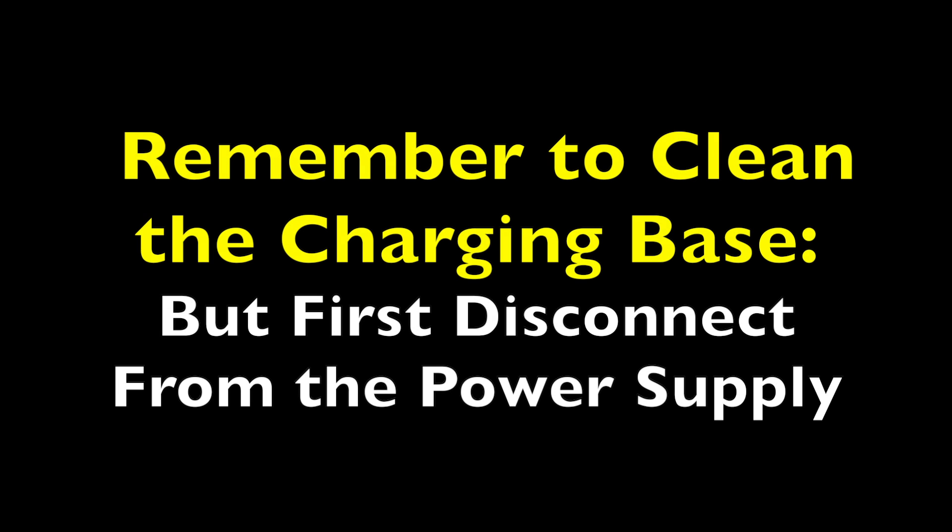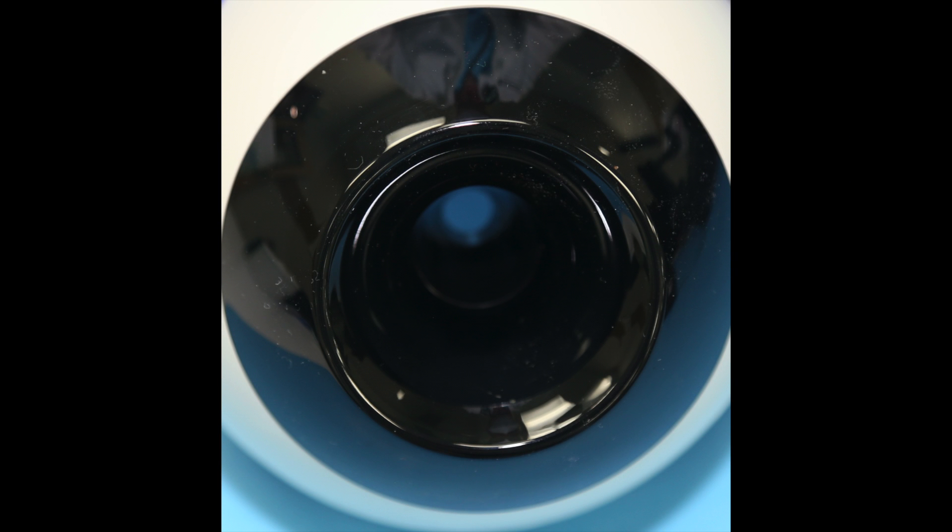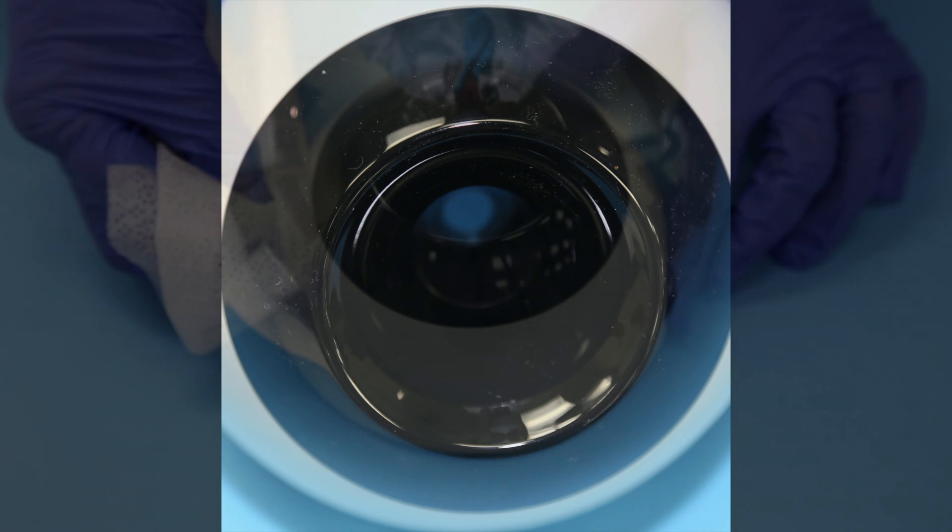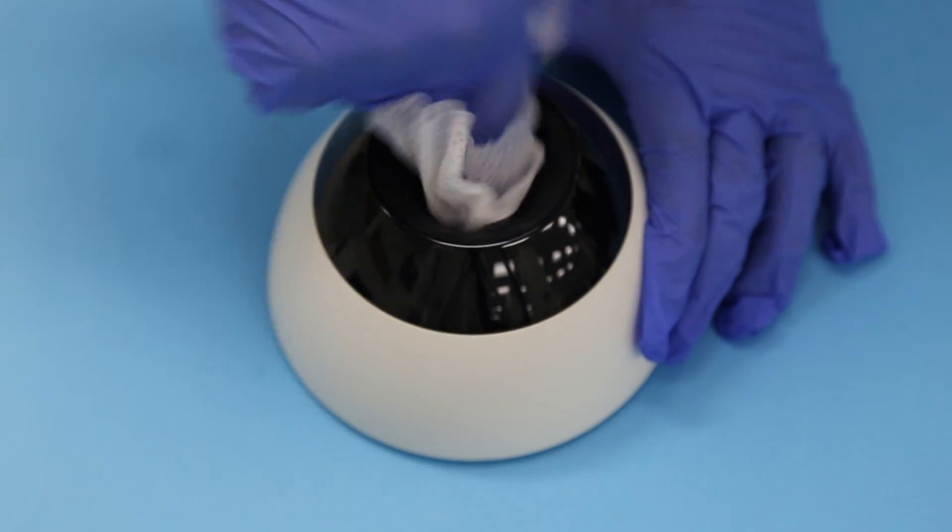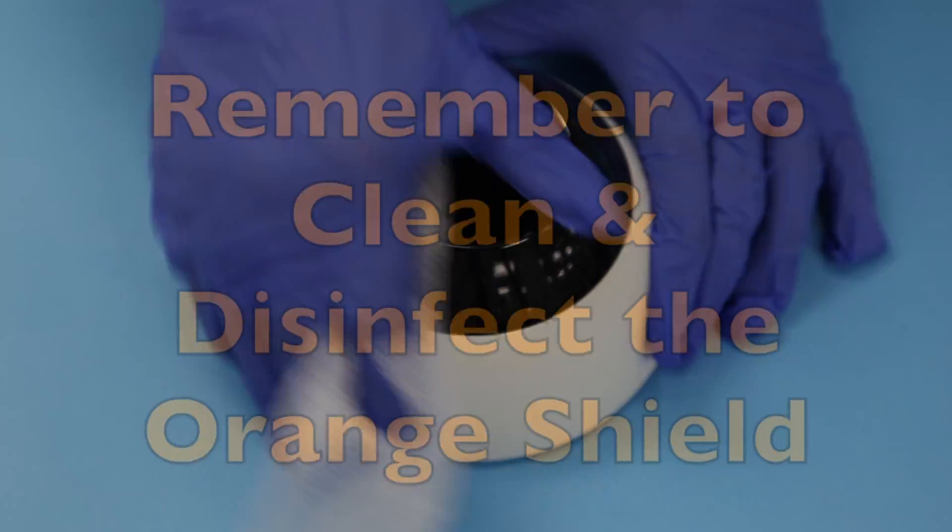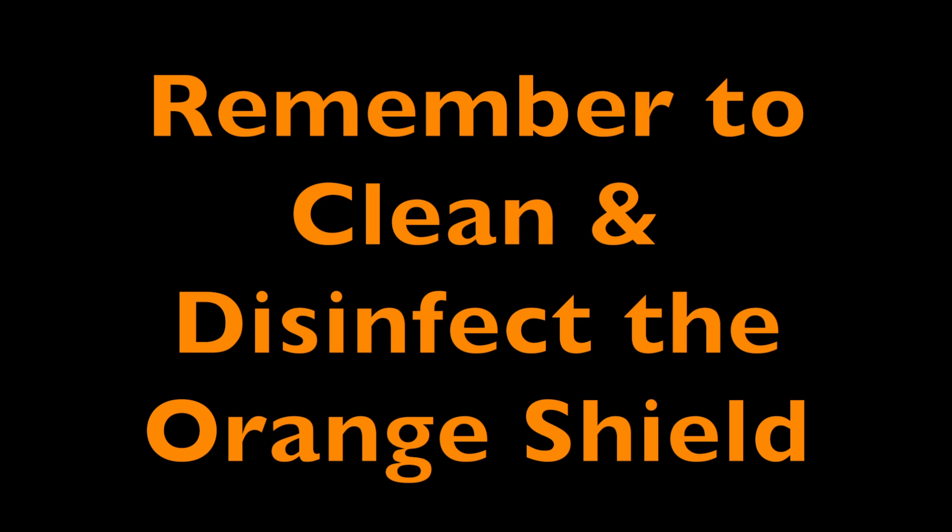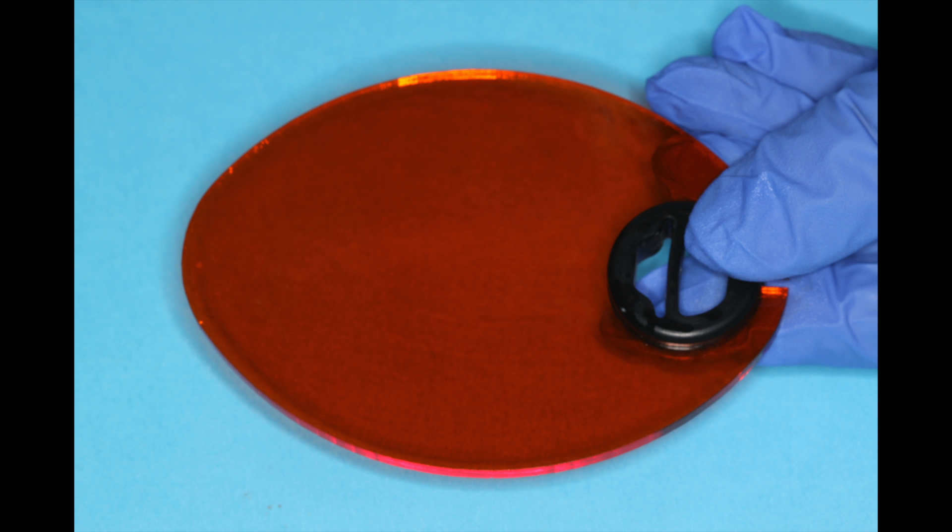Remember also to clean the charging base. In this particular light, there are no charging contacts to worry about. So we can go in, use a wipe and disinfect and clean the entire base. You can clean the orange shield with CaviWipes as well if you wish, so there's no debris left on those.